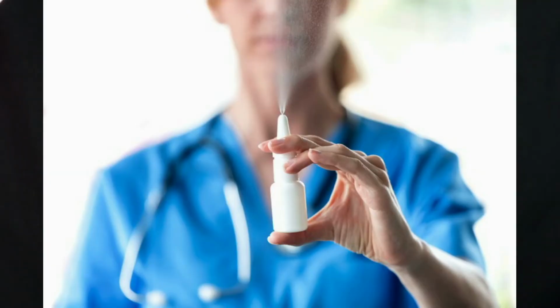I would recommend that before you inhale this spray, make sure you prime it. By priming it, you want to spray about 6 sprays in the air to make sure the spray is working before you insert it in your nose and spray it. Usually you want to prime it before taking it for the first time, or if you've had the bottle for about 30 days and you're trying to reuse it. Or if you just left the bottle open for about 5 days or more, it's recommended that you prime it by spraying it in the atmosphere about 6 times before inserting it in your nose to spray it.